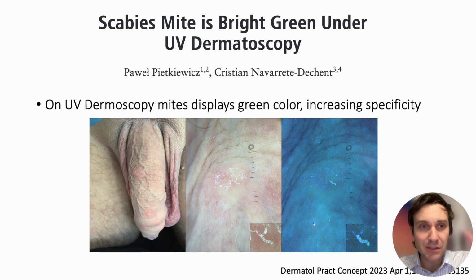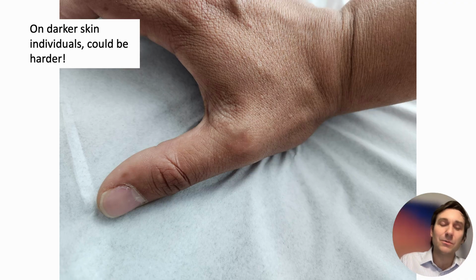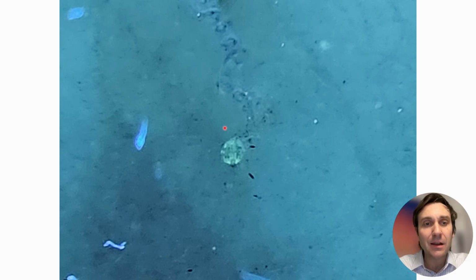Patient, we published this, right? If you're gonna read more about this. This is a patient that has a darker skin type. And on darker skin types, sometimes the delta sign is harder because it's dark, and also with the darker skin, there's no contrast, right? So look at this patient of ours, Latino patient with these burrows here. As I was showing you here, the delta sign, you can confuse this with the background skin. The burrow is different, but with UV dermoscopy, boom, easy. You see this green fluorescent coloration here that is classic of scabies.